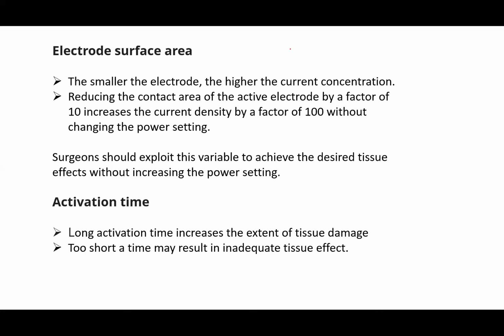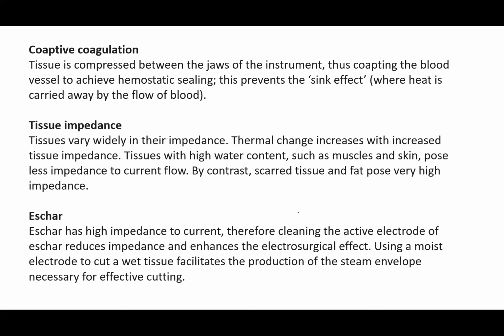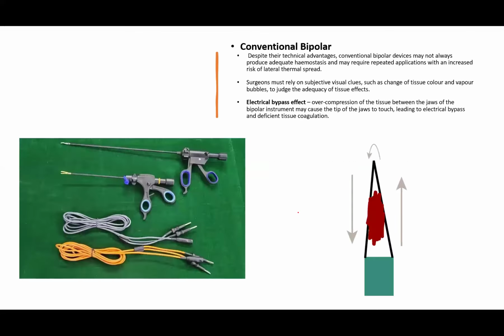Too short a time may result in inadequate tissue effects. All these things may be very difficult to determine with conventional instruments. But with the advanced ones, you will see some measures put in place to bypass these problems.